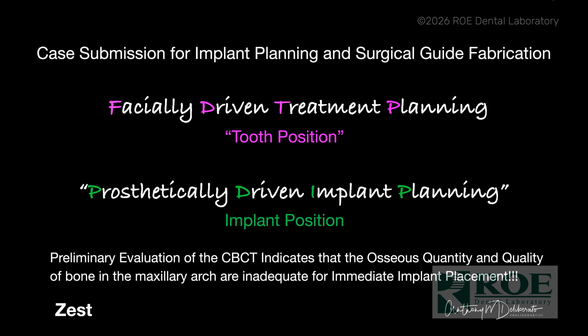Now, I referred this patient to a surgeon, and he took a CBCT, and he told me ahead of time that the quality of the bone in the maxilla was not very good, and that he's not going to be able to place implants immediately. So we knew with this patient that we were going to be placing a maxillary immediate denture on the day of surgery.